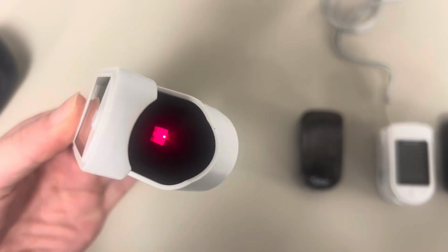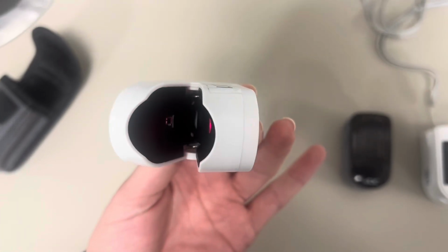So how does the pulse oximeter really calculate all these levels? The device works by shining red and infrared light through your finger to a sensor on the other side. Oxygen-rich and oxygen-poor blood absorb the light differently, and the device uses these differences to calculate your oxygen saturation levels.